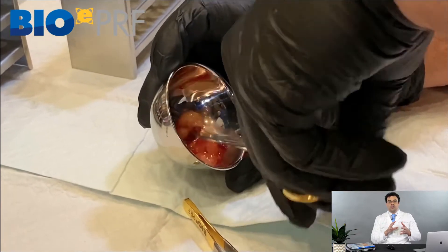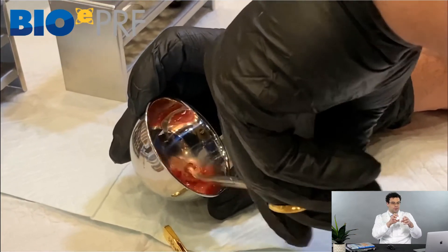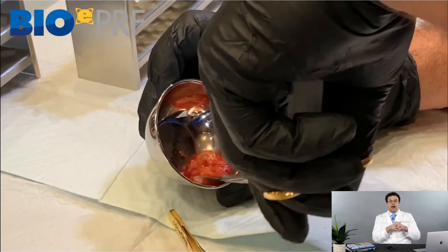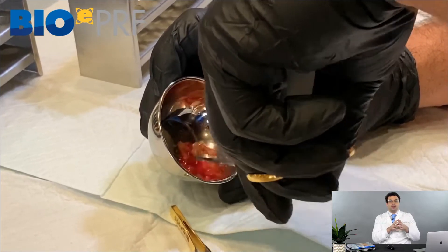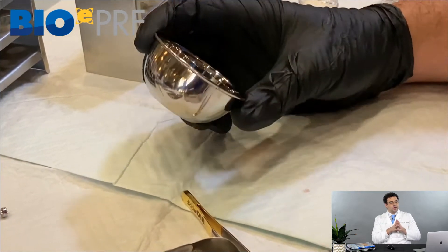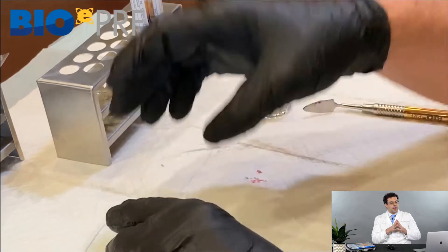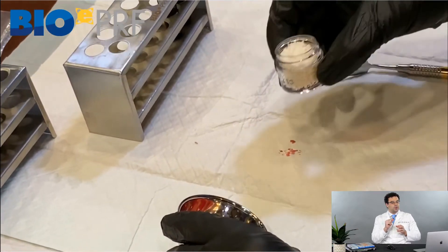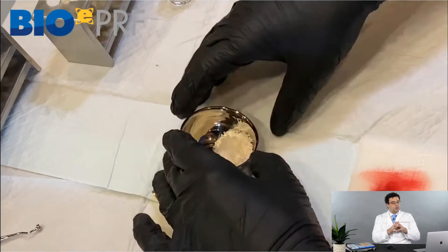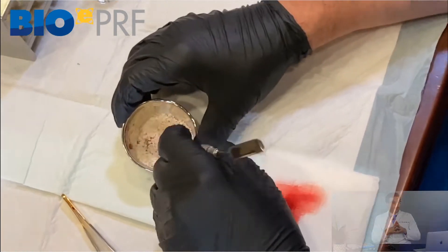The reason is that when fibrinogen and thrombin convert into fibrin, if there are already little fibrin fragments present, future fibrin can clot from the fibrin that's already formed. So this acts like a little nucleus. If I make it, cut it up this way, and then introduce the bone grafting material, I have all of these little bone grafting particles that are going to be coated and surrounded with the PRF fragments.